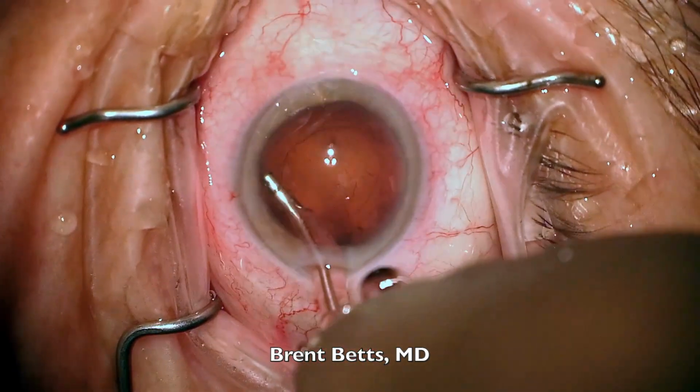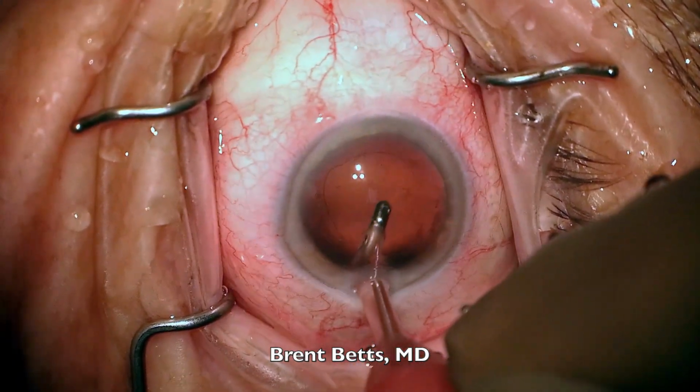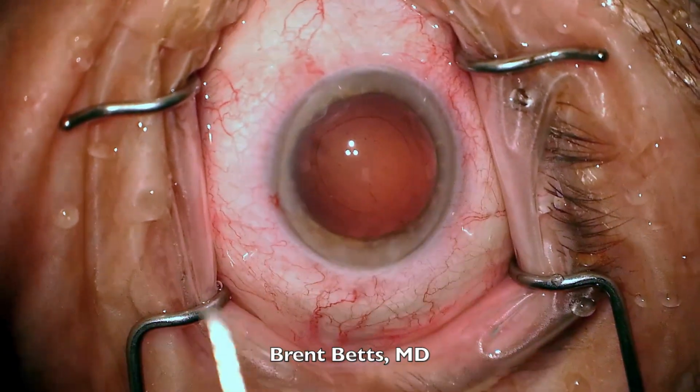There are always residual cataract cells left behind, cataract or lens cells. The more of these you can remove, the less scar tissue you end up getting after the surgery. Additionally, I do gentle polishing of the posterior capsule with the IA device.